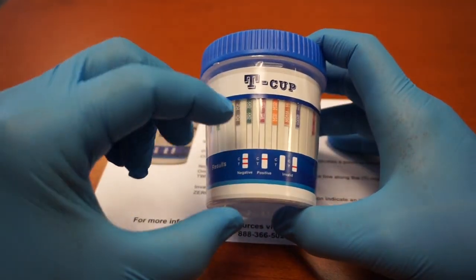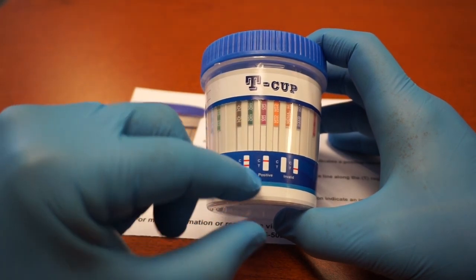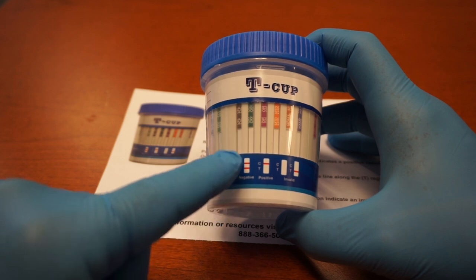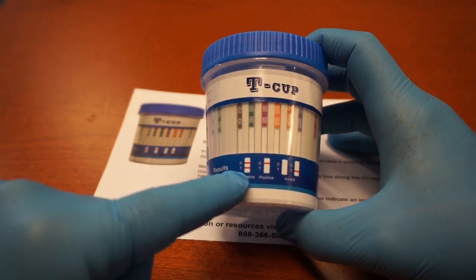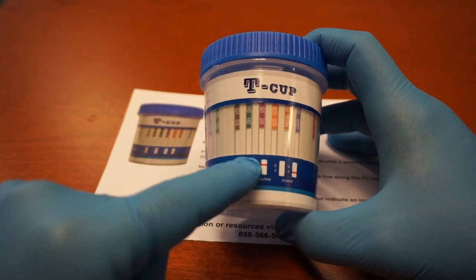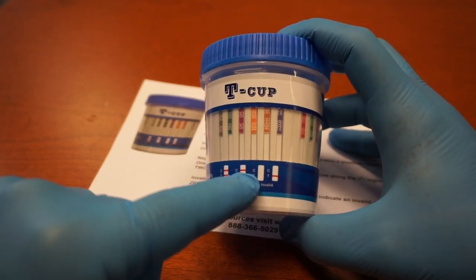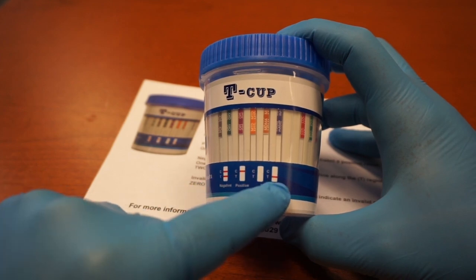Each one of these strips will either show a negative, positive, or invalid reading. For a negative reading, it will have two red stripes. For a positive reading, it will have one upper red stripe. For an invalid reading, it will have either no stripes at all or it will have a lower red stripe.